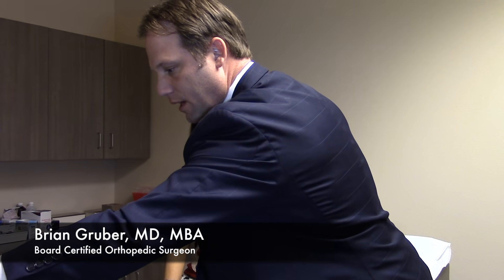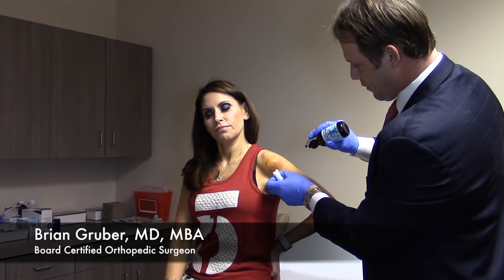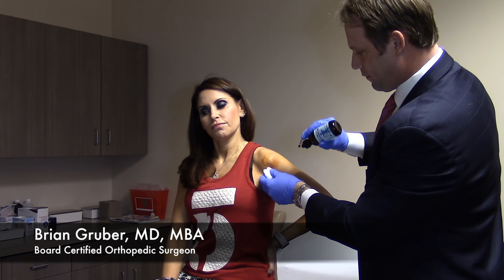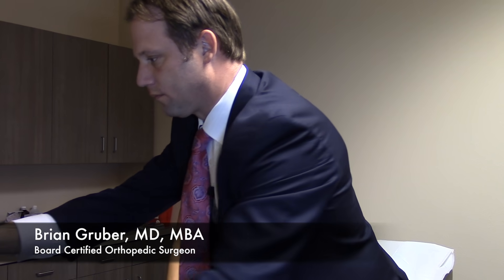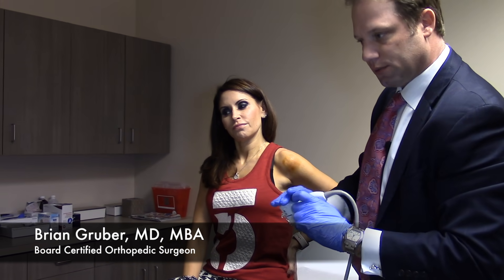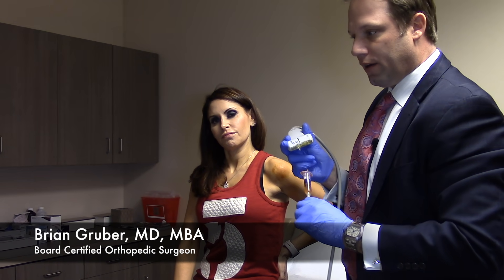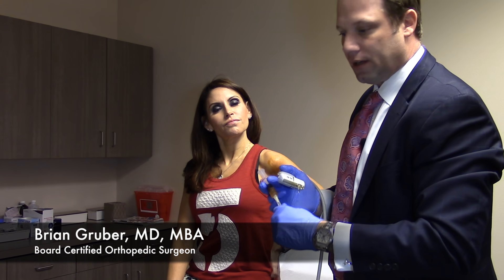So now we've cleaned the area and next we will numb it. I'm going to put a fair amount of the PRP injection into the rotator cuff, needle it as we do that, and then put the rest into the subacromial space — which is the area adjacent to the rotator cuff. Julie has some bursitis or inflammation in that area, and that will help with that as well.